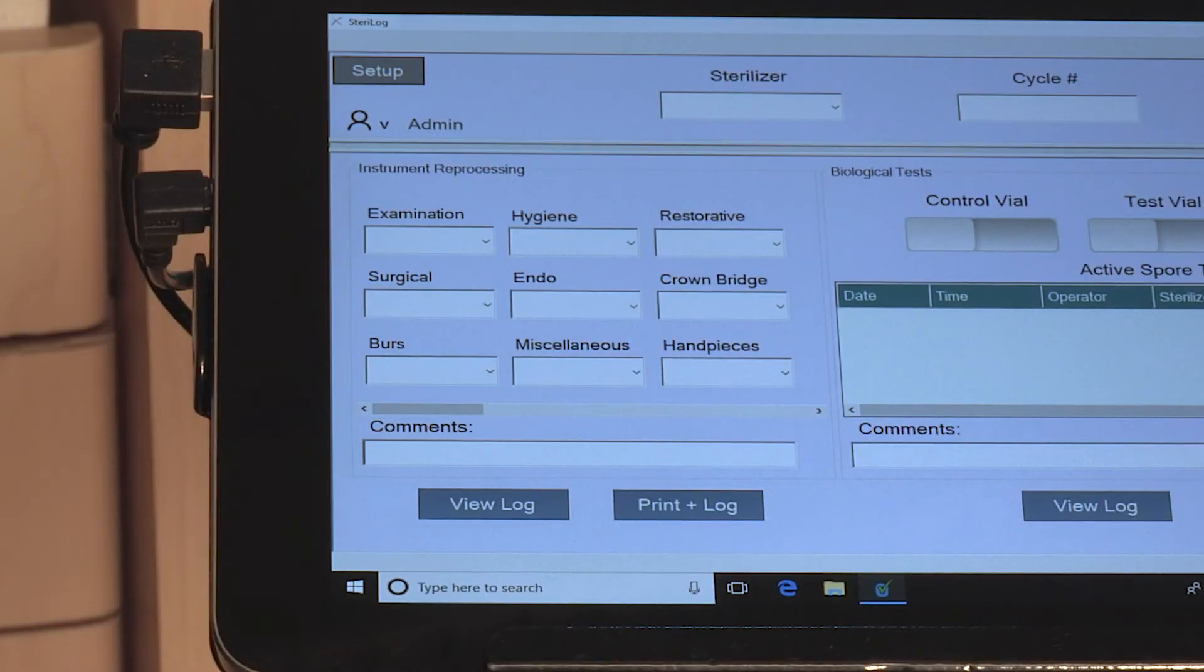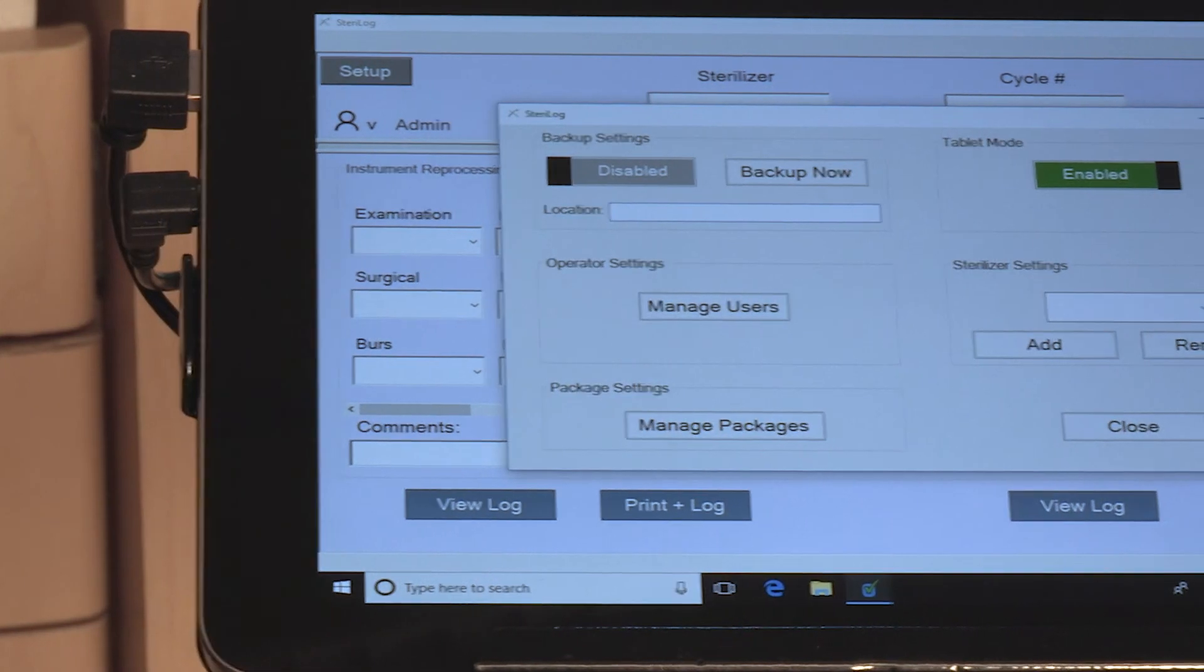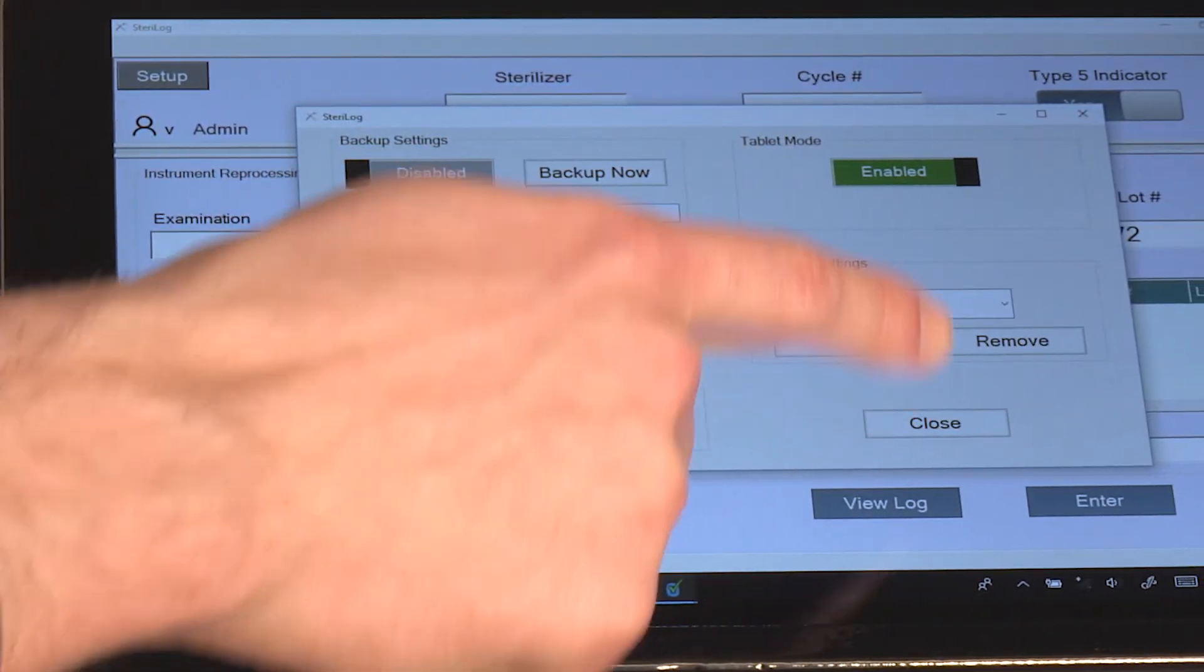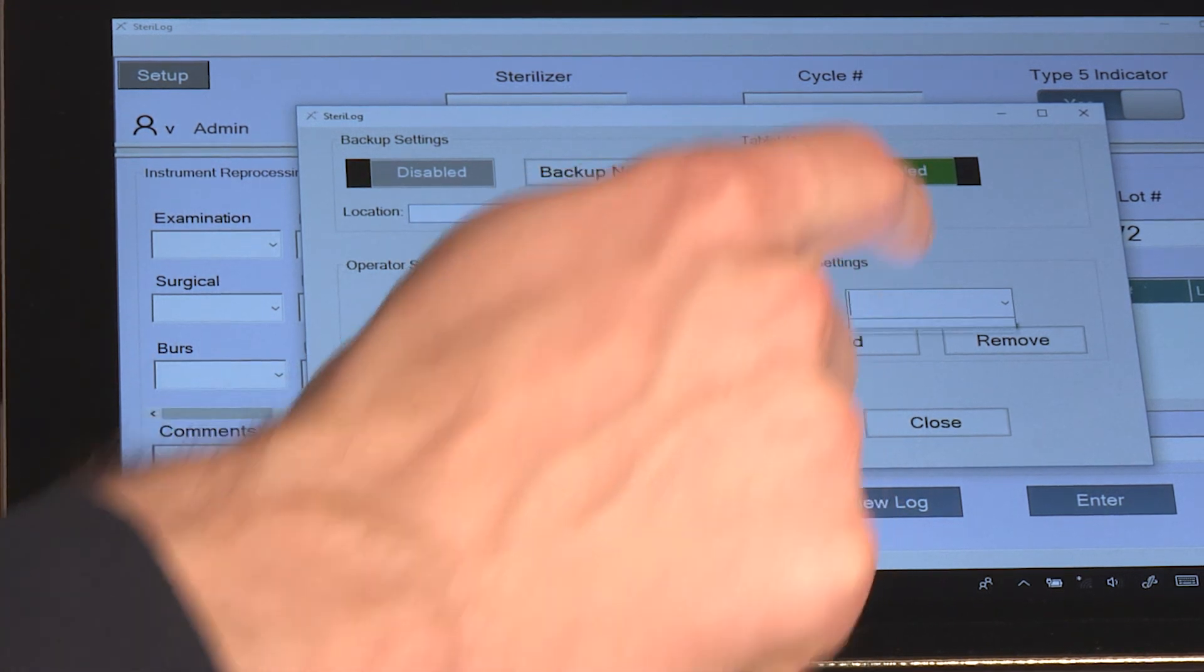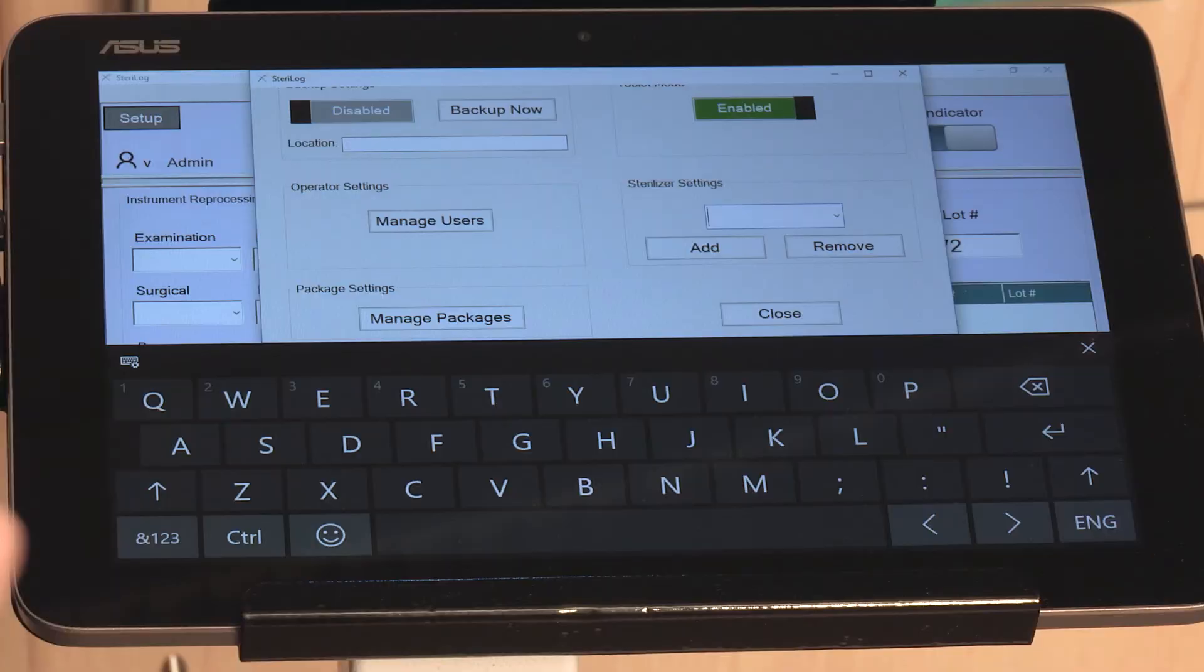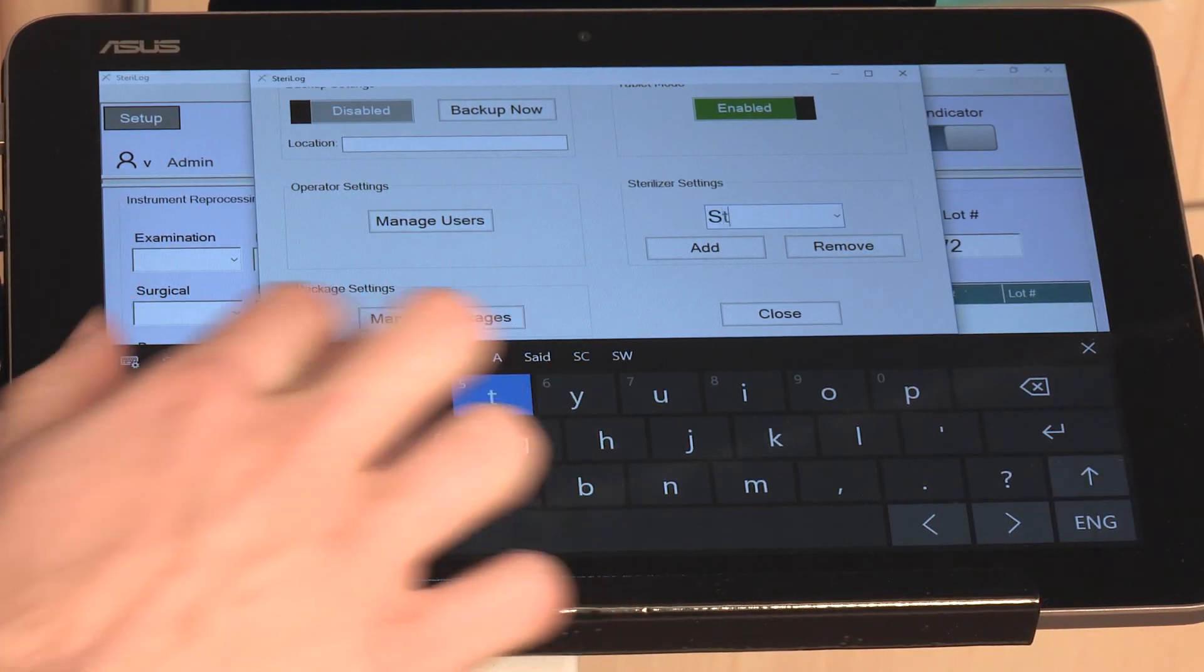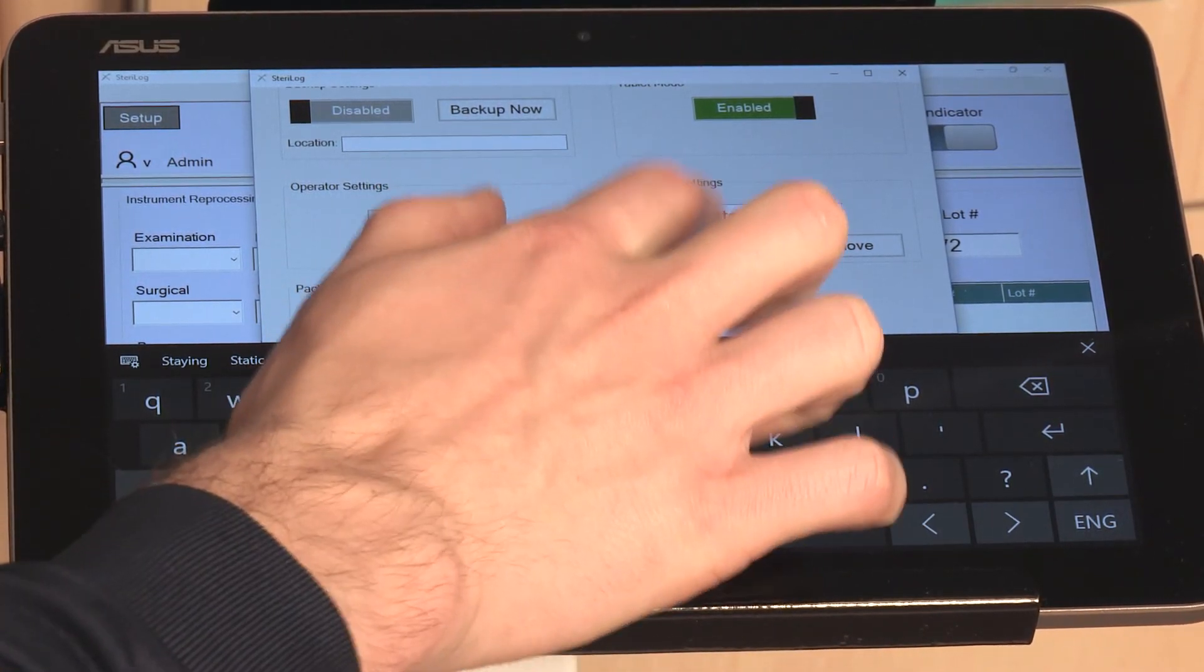To set up your sterilizers, you would hit Setup and then notice this area here where it says Sterilizer Settings, so you can key in the name of your sterilizer. So for example, if I wanted to add a Statin, I would simply key it in here and hit Add.